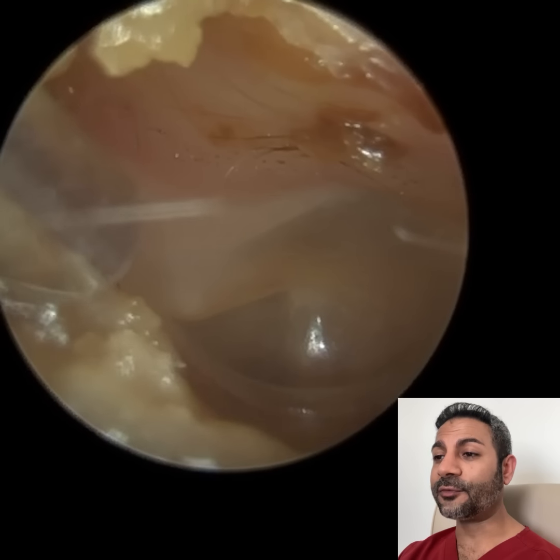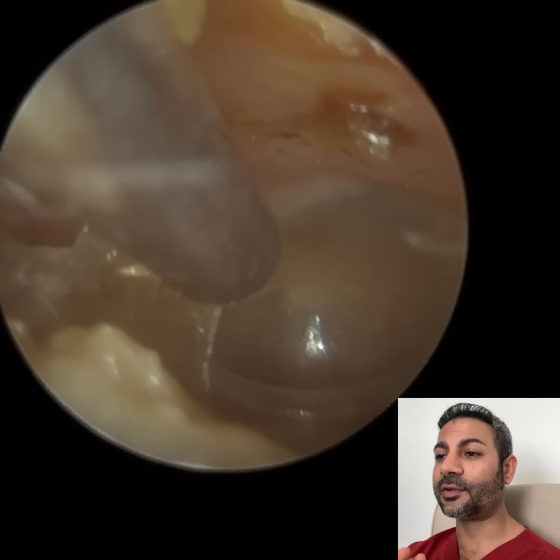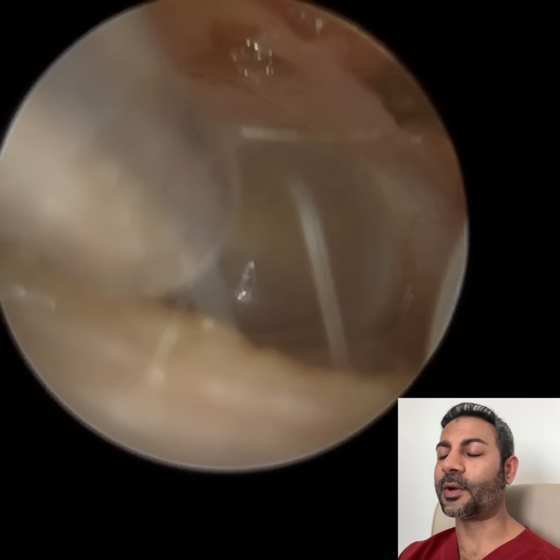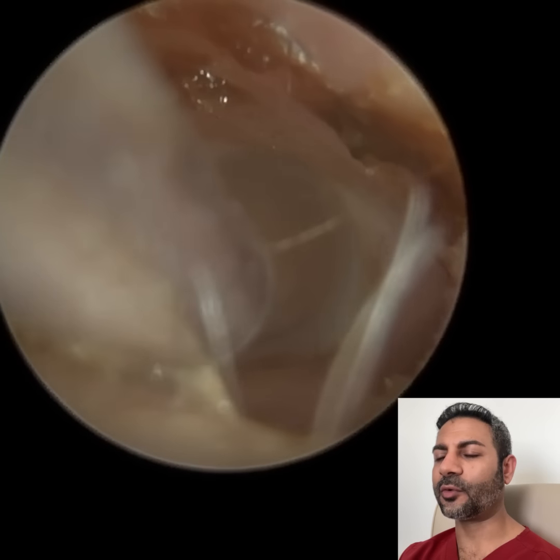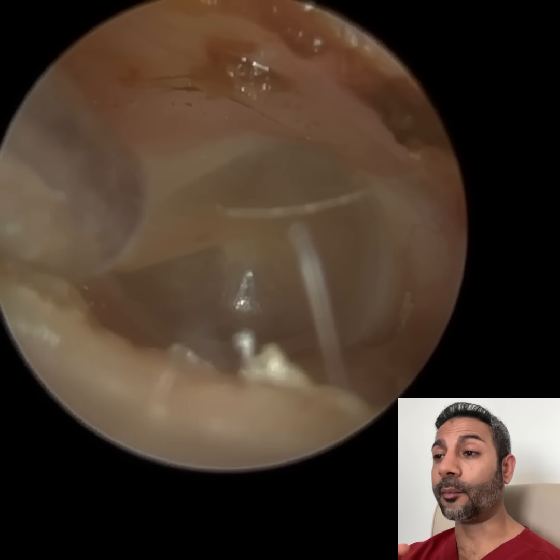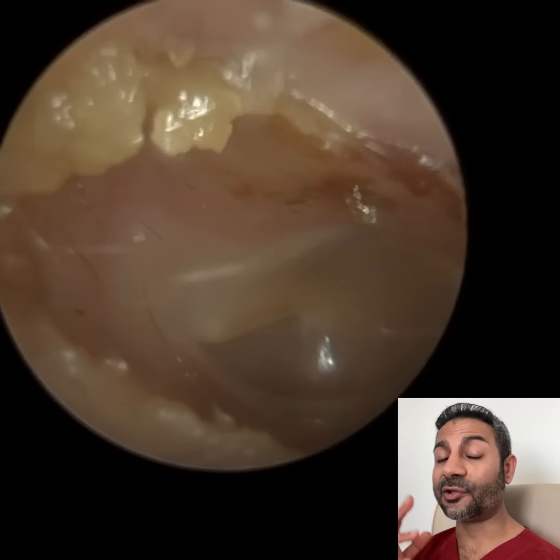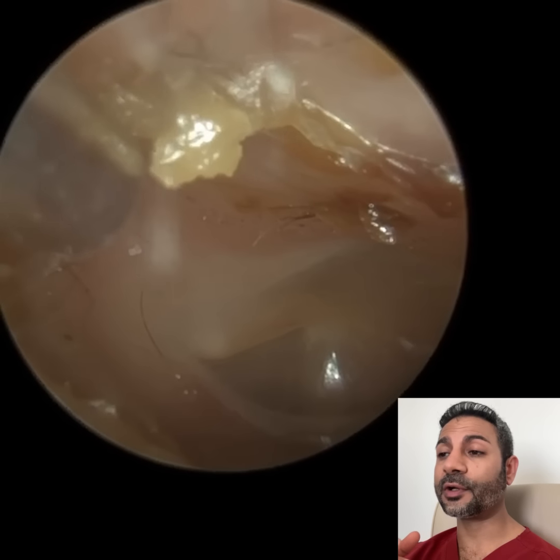In their right ear, although the ear was clear per se, there's no occlusion, it was a bit damp on the eardrum, which I mopped up. Sorry, I've deleted the video because it was a very short video, and I should have shown you guys, because I did do some work on the eardrum there, but it was very quick, just removing some of the dampness. But they did have a lot more fungal spores and hyphae on that side. So it's very likely they've got aspergillosis, which is a form of otomycosis, a fungal infection.